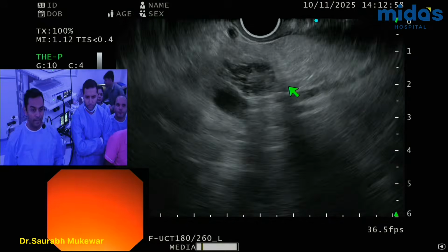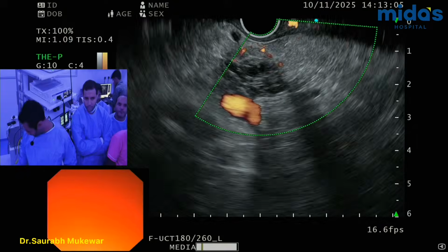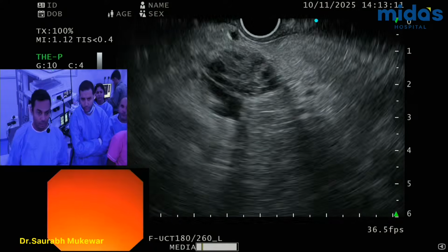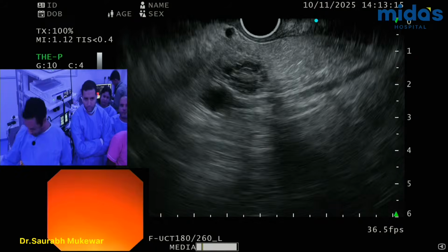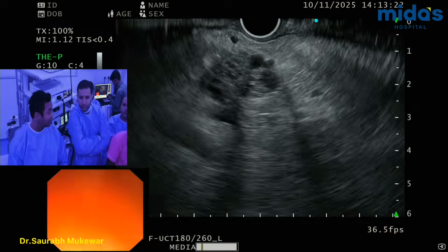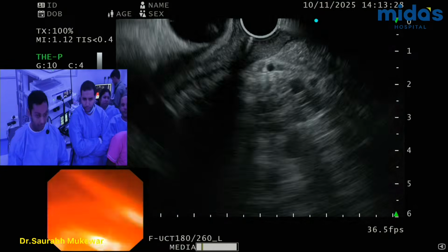All right. So what we want to do is, when you're doing a biopsy, you want to position the needle in the lesion in a manner where it's on the left of your screen, so that when the needle comes out, it's going to hit the lesion straight and obviously in an avascular path. Yeah, it's an Olympus. The blue dot is on the right of the screen, right? So that's where the blue dot is, and then we are going to go from there and get the lesion. All right, perfect.